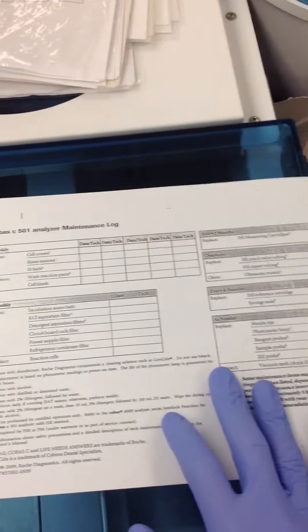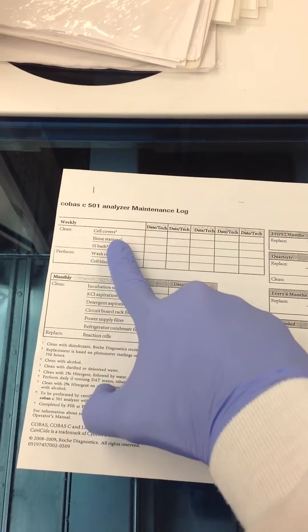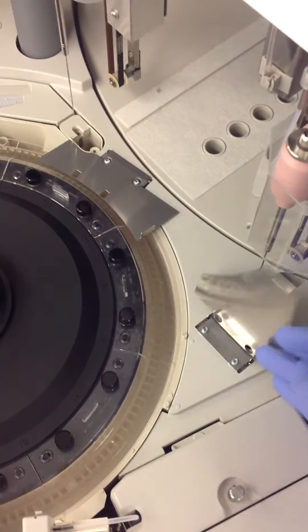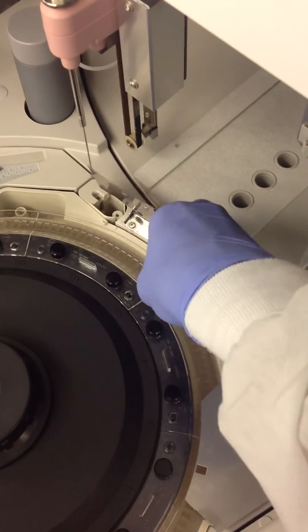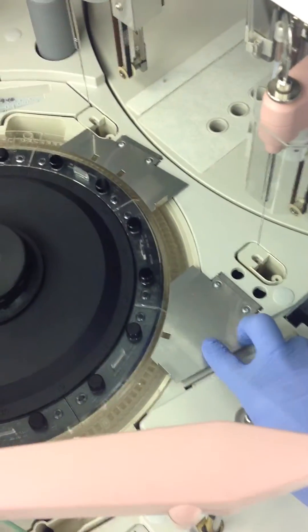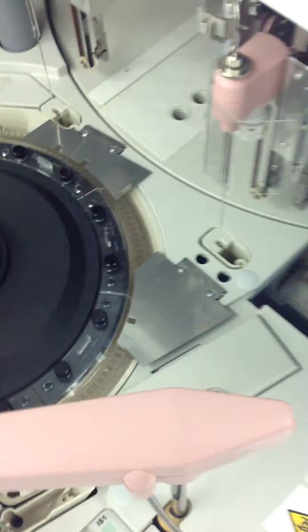Starting with the 501, the first thing you want to do is clean the cell covers with alcohol. The cell covers are these little guys here. You're going to clean the top and the bottoms of these two cell covers, although we usually clean them every day because they get dirty rather fast.